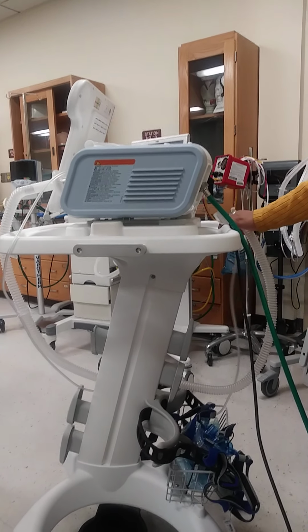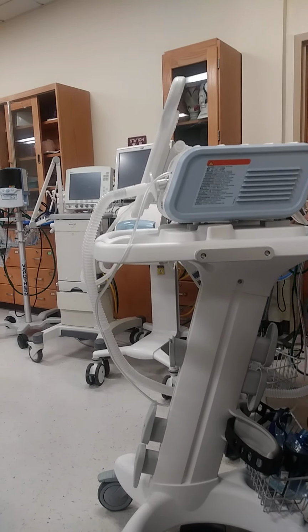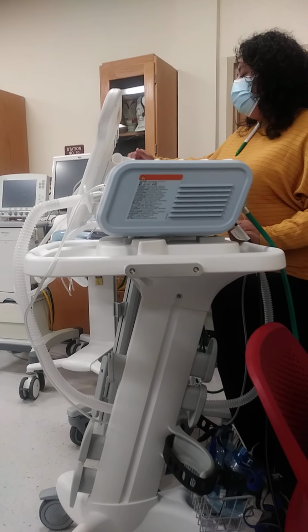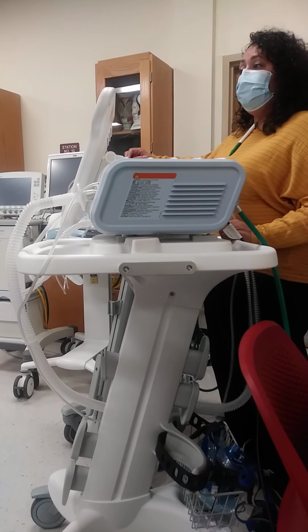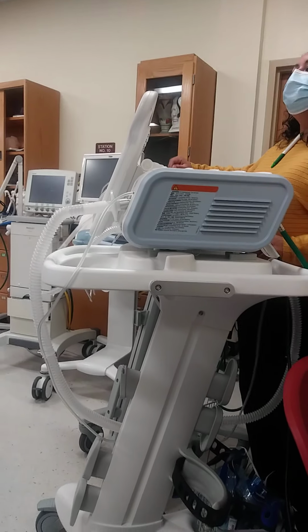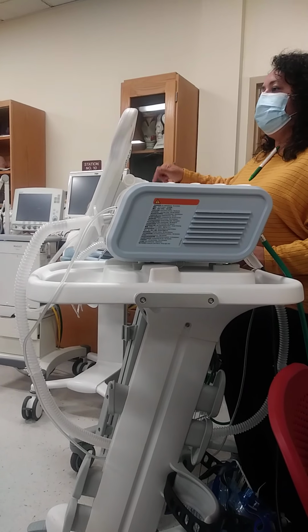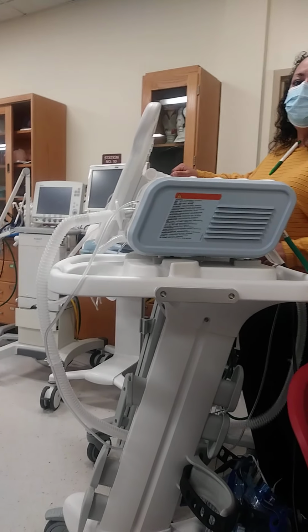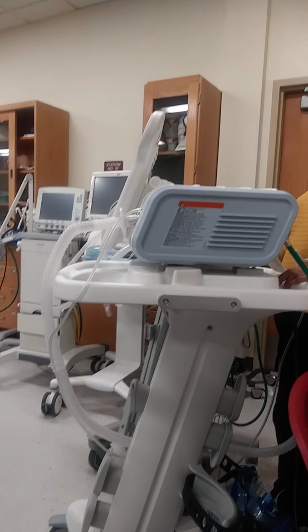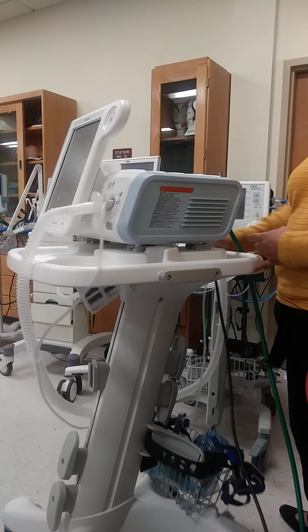This one does not have a backup battery. So when I started working in the hospital, there was a night that I had like 8 patients on this, and our lights went off, right? And the generator didn't kick in. So my supervisor called me and he said, Delmy, take off all your patients from the BiPAP. Put them on oxygen because these don't have a backup. Otherwise they suffocate with the mask on, you know? Just have a mask on and not comfortable. But these do, and these will tell you that they're working off the battery, okay?